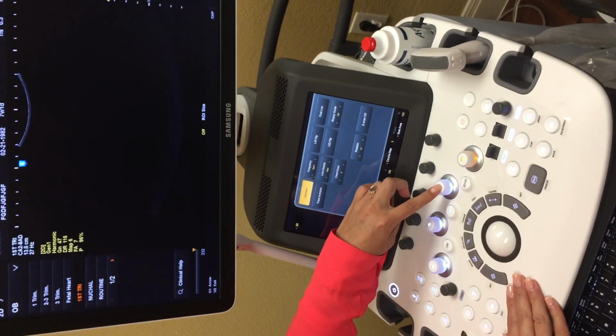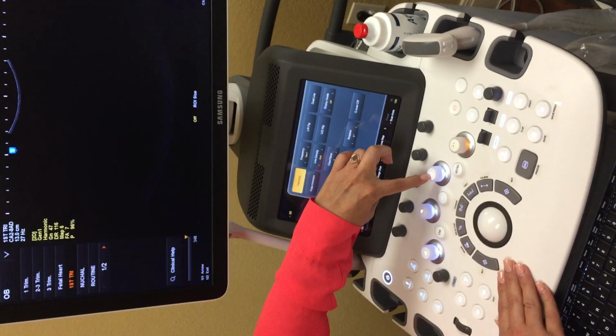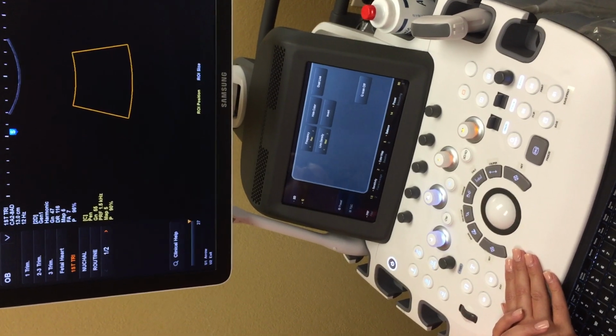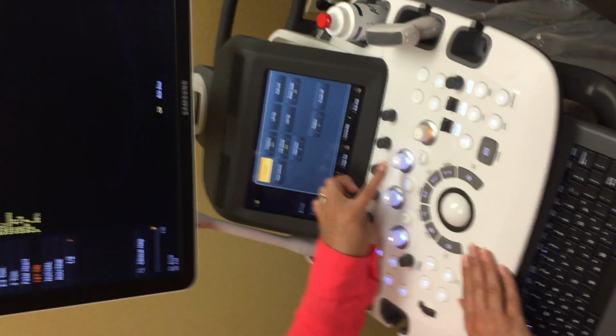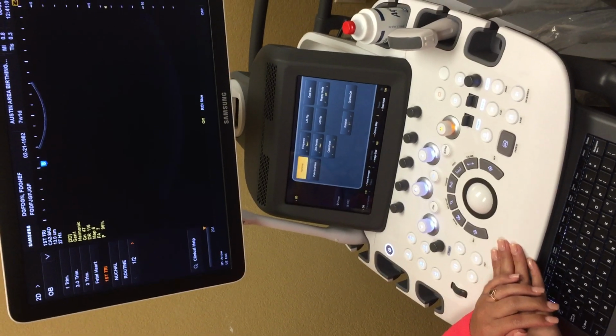If you're trying to rule it out, for sure, especially. Yes, absolutely. So here's your color. You just pop it in, put it in there. Cool. On and off. Color on and off. This is exciting. It says C. There's a C. Yep. It'll be a C right there.